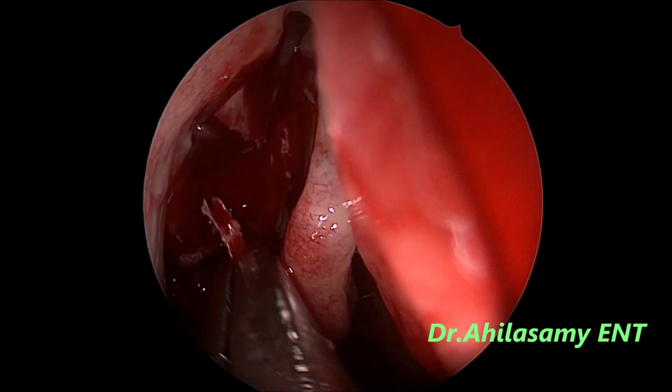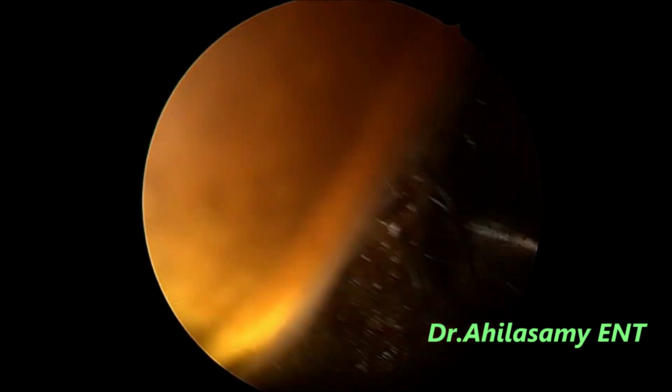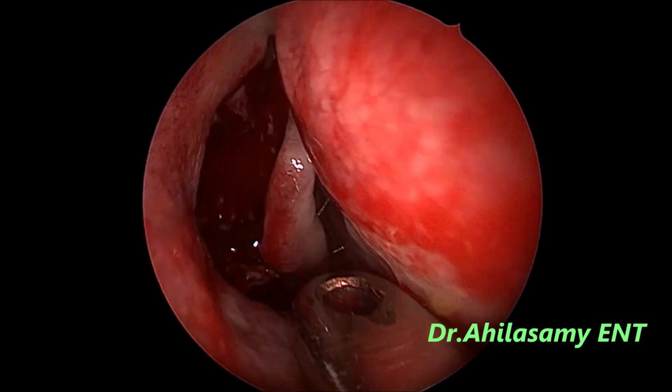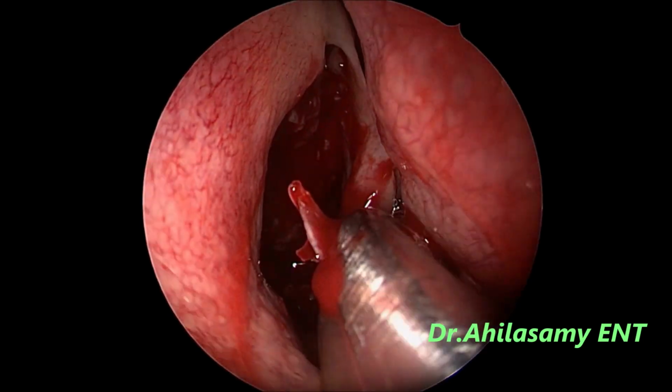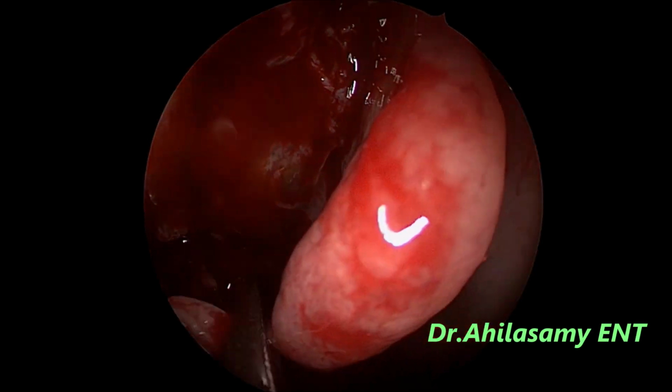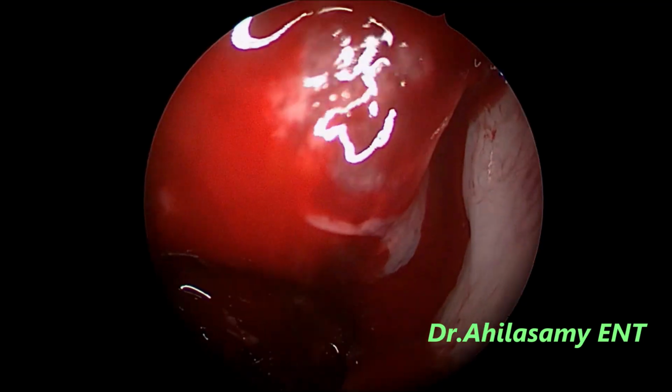So the uncinate has been removed. Next, I will be removing the bulla. Of course, in this case, the disease was very less on the right side. There is some significant deviation of septum to the right side, but I can manage. So I will not be doing a septoplasty in this case. Of course, if you feel, you can do it.